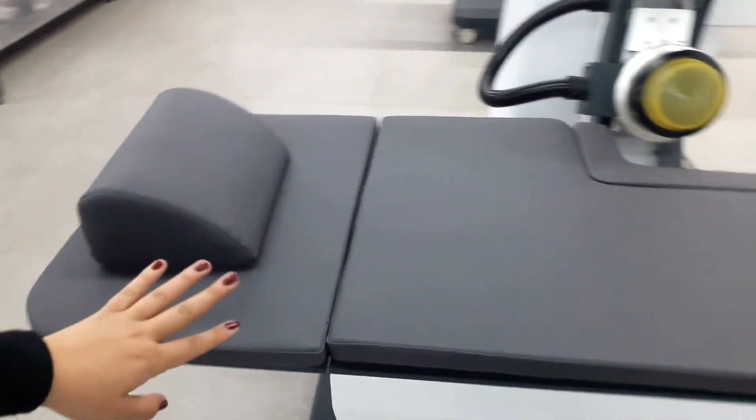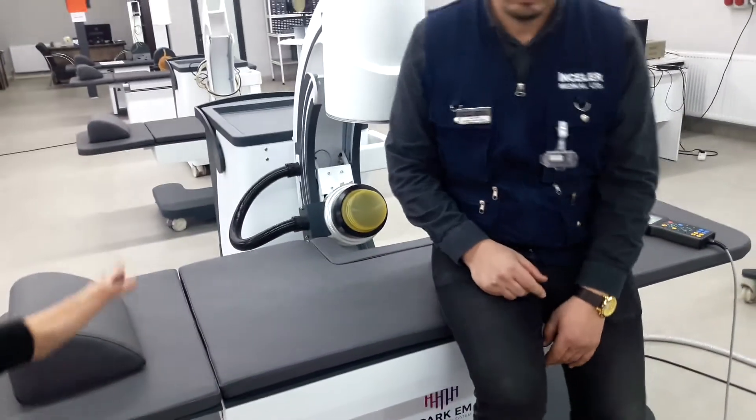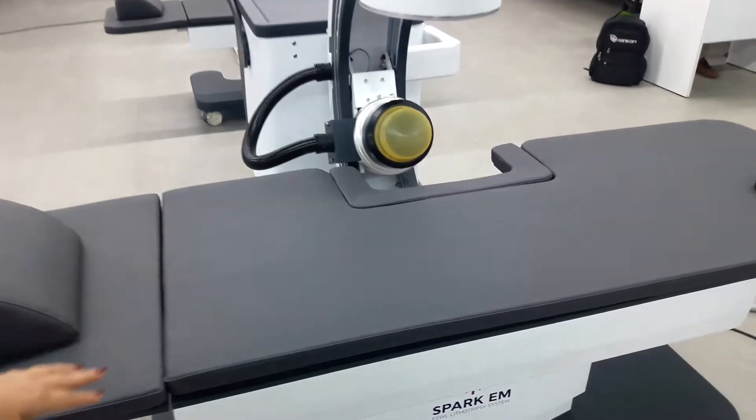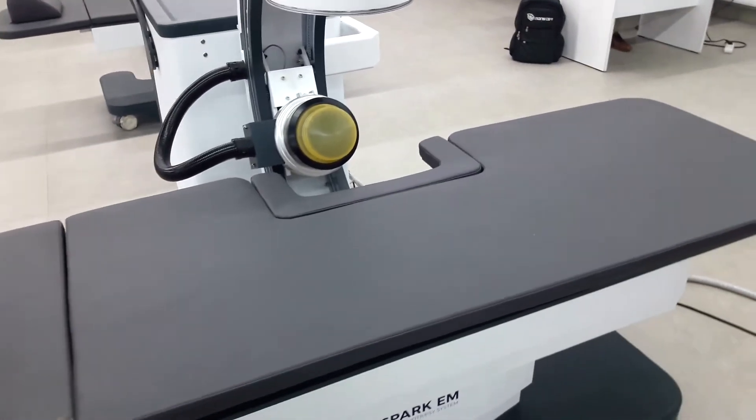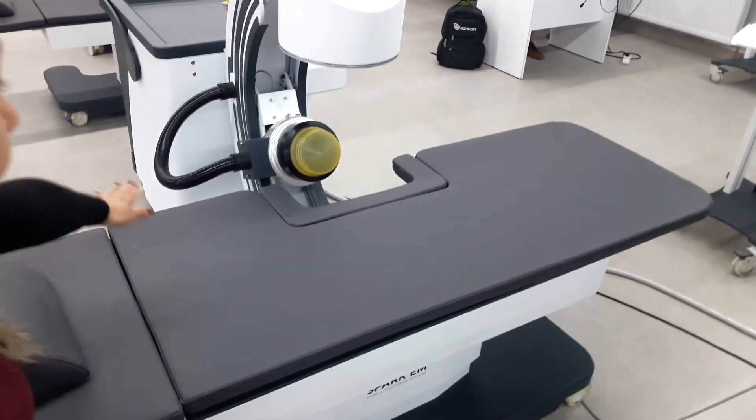Here is the treatment table of Spark EM. It's very flexible — even elderly patients can lay down easily. It moves right and left, back and forth, and up and down.